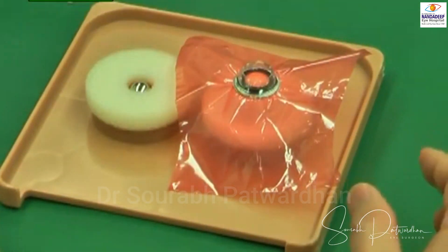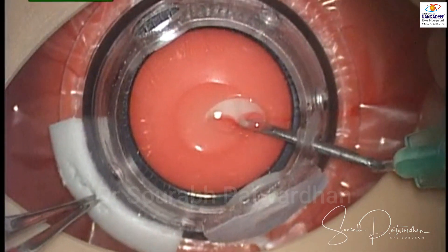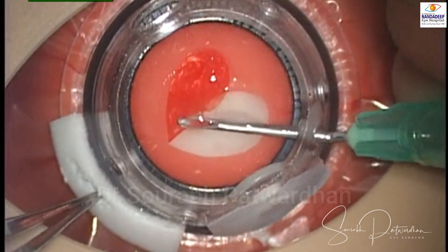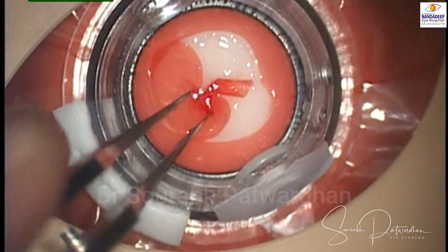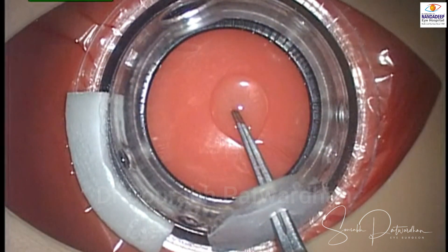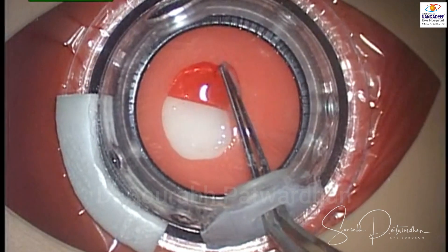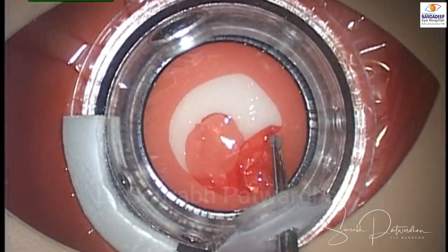In the dry lab setup, a gelatin paper is placed on clay, and over that there is an acrylic cap which has pre-prepared holes in it for the side port incision. Through it, you can go with the cystitome and try to mimic the same movements you are going to use during surgery — use the shearing force, use the ripping force, and try to make a capsular rhexis of good size. You can also use forceps for doing capsular rhexis, and this doesn't require even a microscope, so you can use it any time you like without any surgical setup.